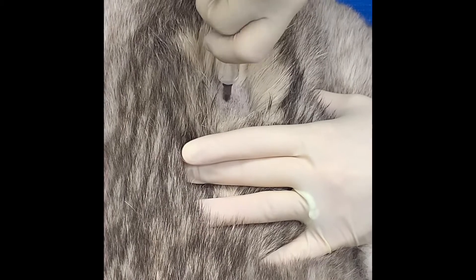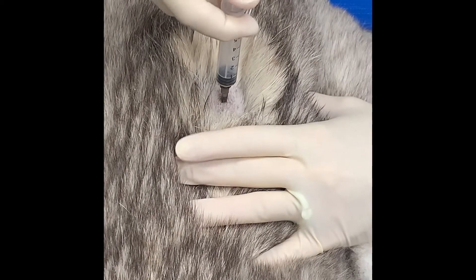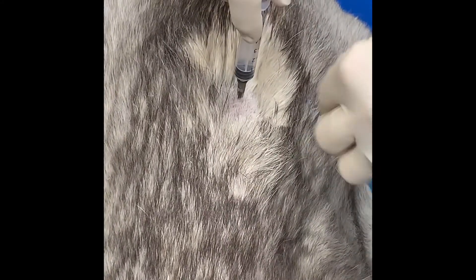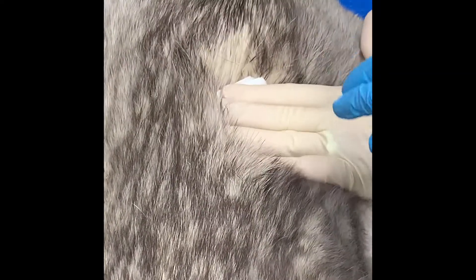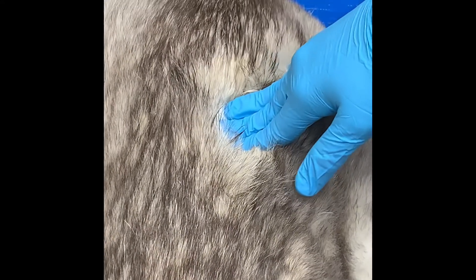Once the imidicide is given deep into the epaxial muscle, they will put some gauze on top and hold the area for at least three minutes with a three-finger pressure hold. That's how you give imidicide.